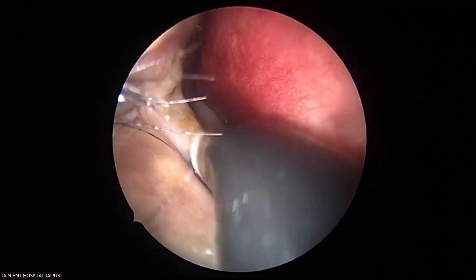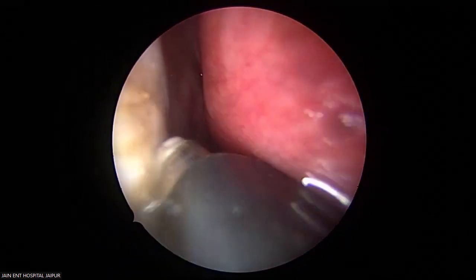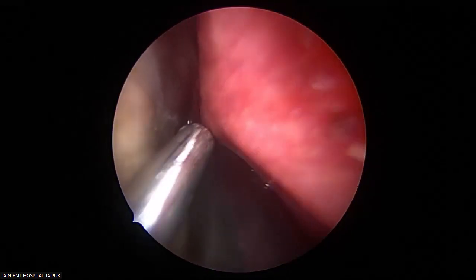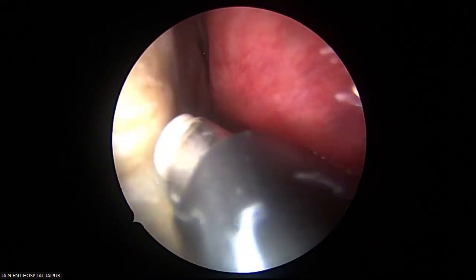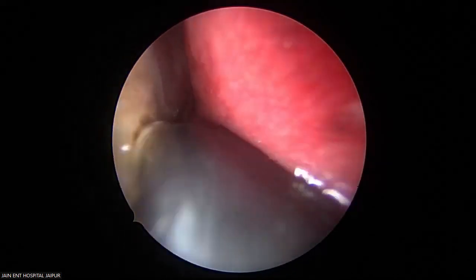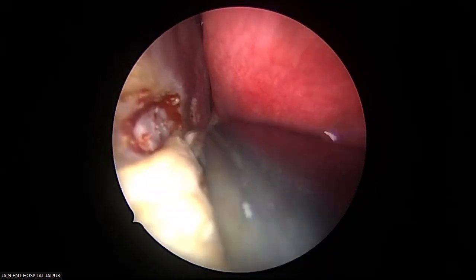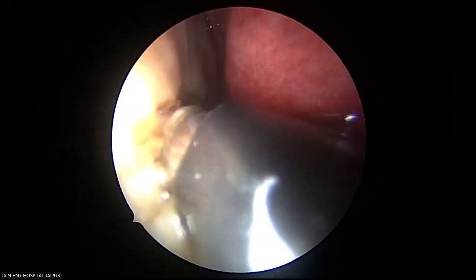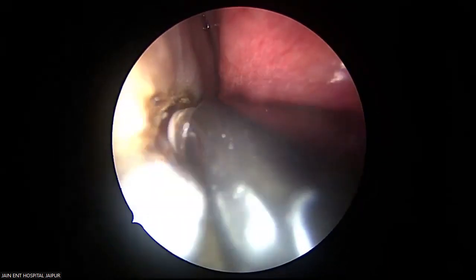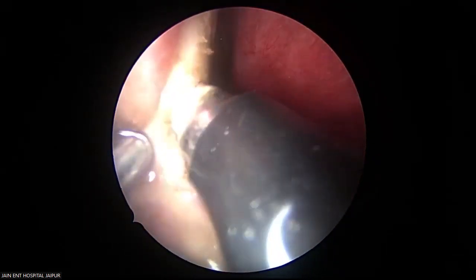See, I am right at the aperture. If you come a centimeter anterior, you are going to damage the alar cartilage, and that's a disaster. Then you need to reinforce with cartilage. Now, I'm using the cutting one, removing this mucoperiosteum. This coblator doesn't work on the bone. Never try to use it on the bone, otherwise that will ruin the wound.